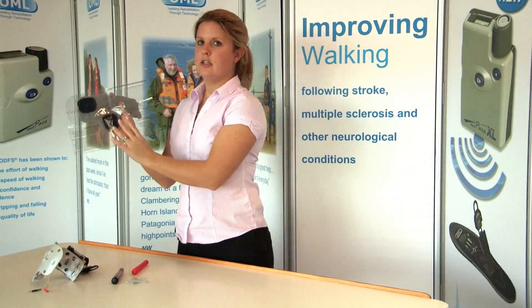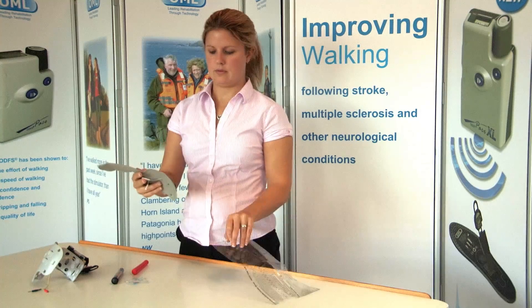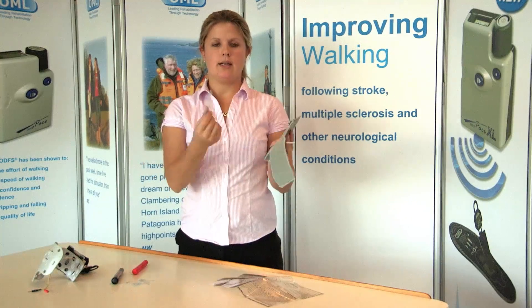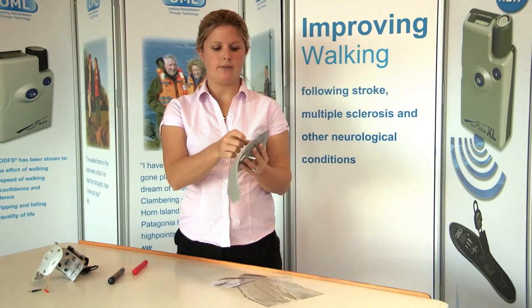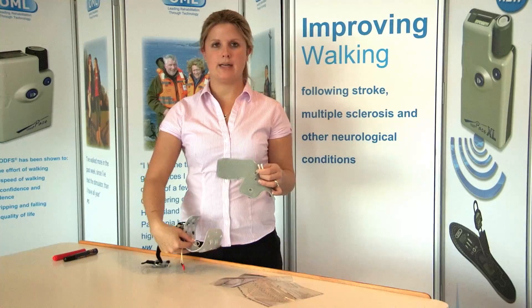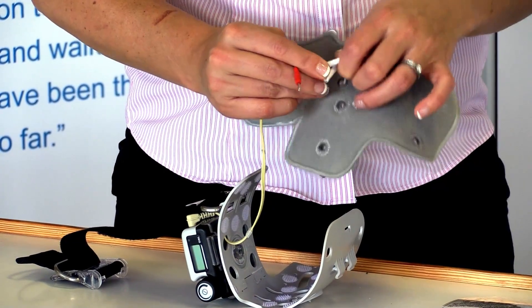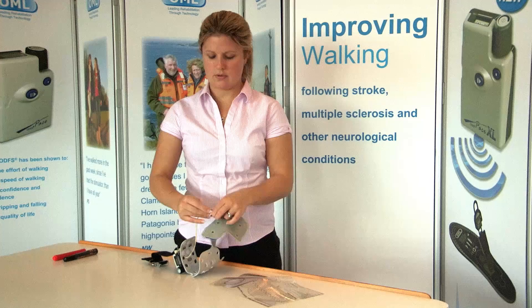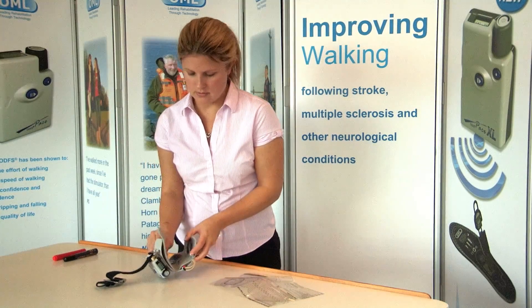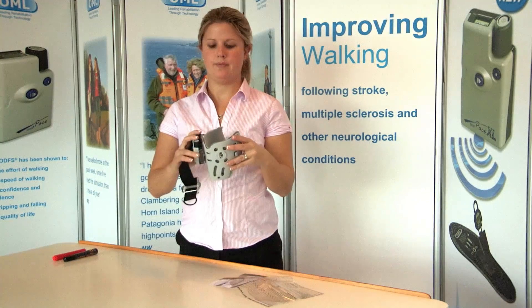Once you've done this, gently peel the locator sheet away from the electrodes, and that is done. Now put the leg cuff liner back into the leg cuff shell. Stick the covers over the electrodes to make it easier. Take hold of the electrode lead socket, take hold of the cuff, and place it face down. Plug the black and red in as required. Fold the liner in half and insert it into the shell. Once done, neatly tuck the lead back in, and you are finished.